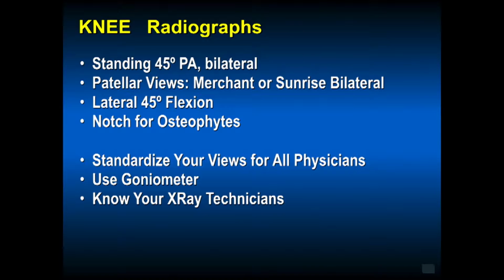Knee radiographs should also be standardized. If you can convince your partners or department to get the same views, then studies can be more easily done or patients can be compared year to year. Typically the views in the knee, you do want to get standing views. The degree of flexion can vary, but if you're consistent with a degree of flexion, then you can talk to patients with osteoarthritis and show them X-rays year to year to better counsel them on if their osteoarthritis is progressing.